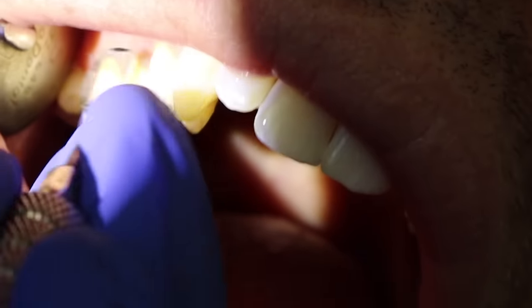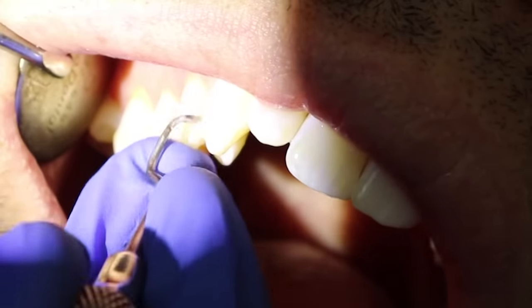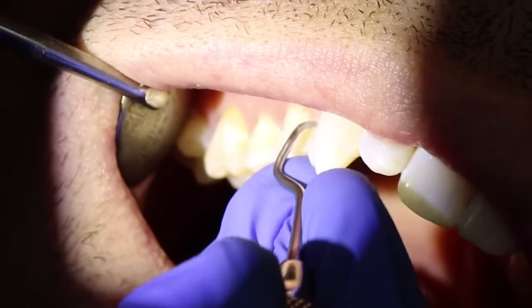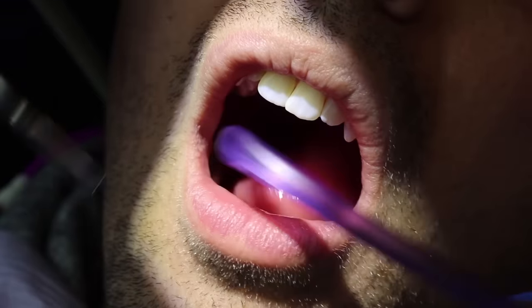Here I'm using a scaler. Scalers are more pointy. You can also use curettes, which I love as well — I'm just not showing that in this video. Curettes aren't as pointy.